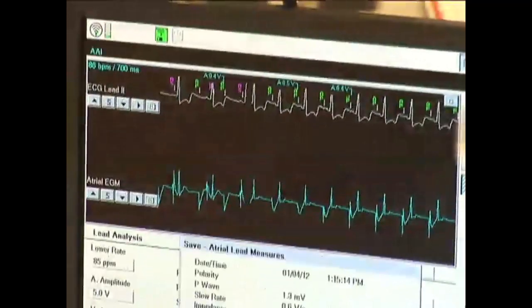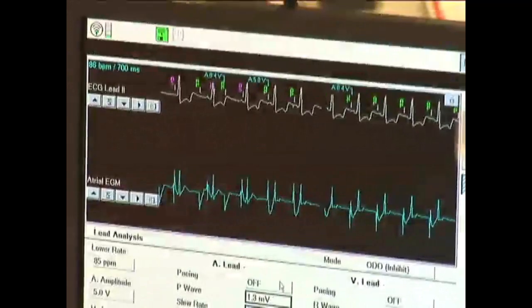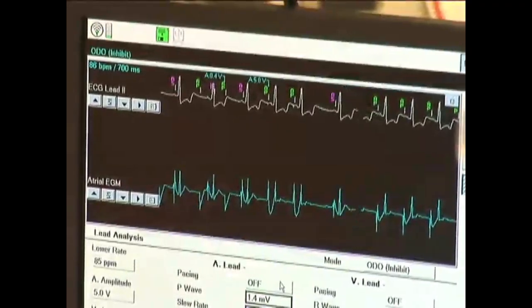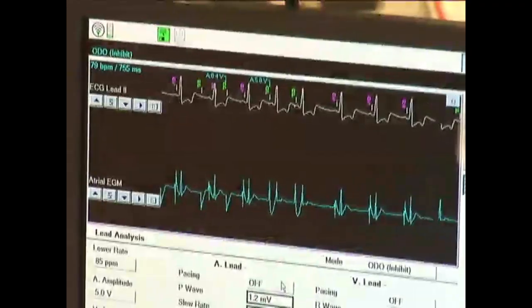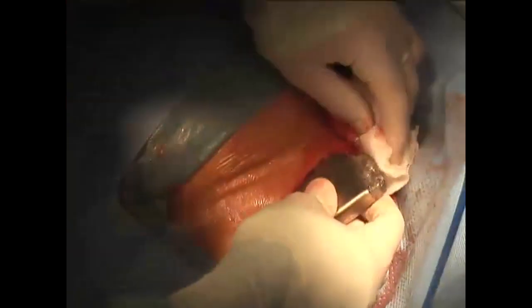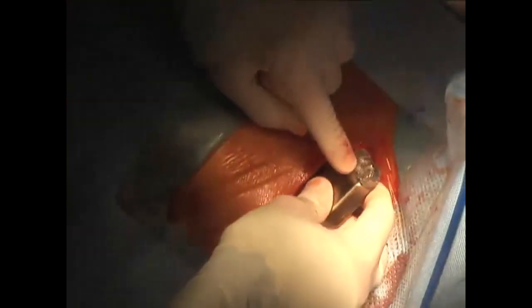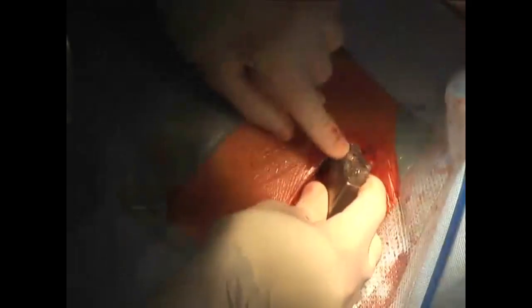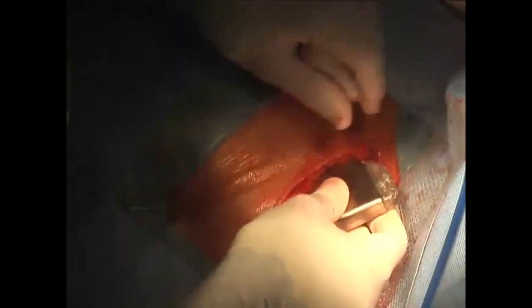The leads are checked through the pacing system analyzer for sensing, threshold, and impedance. The new generator is attached to the leads, with care taken to ensure the pins are past the set screw when the wrench is used, and that the pacing and shocking pins are placed in the correct ports of the header. The generator is placed in the pocket.